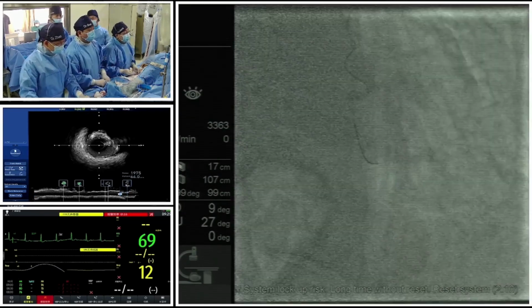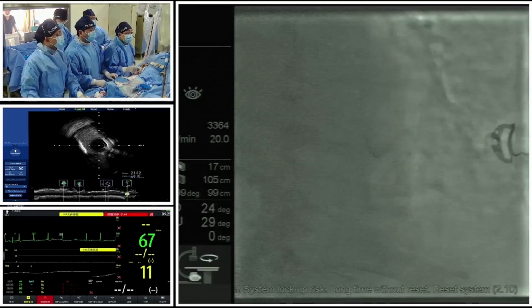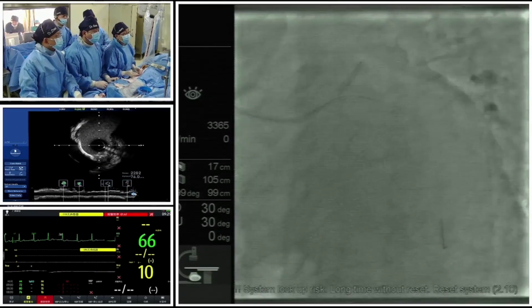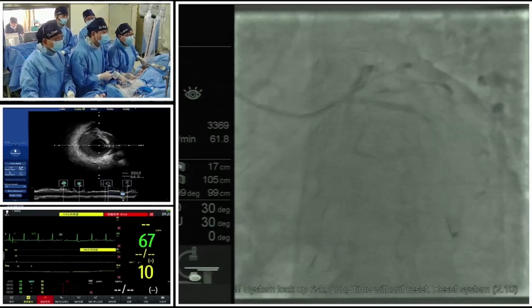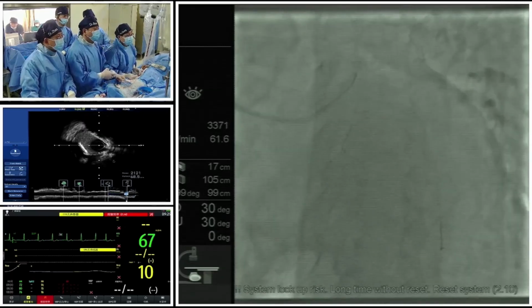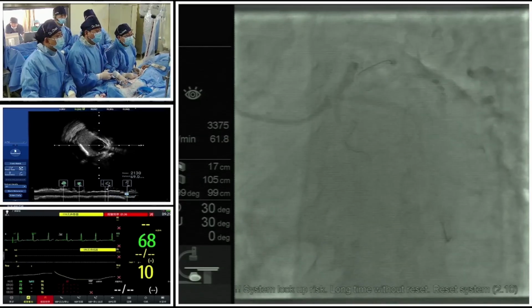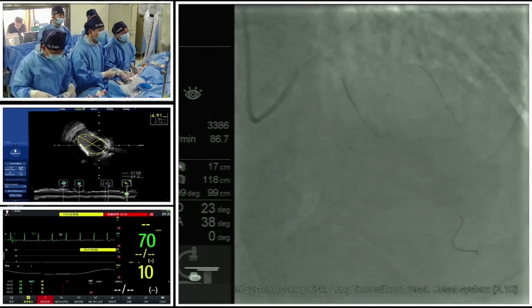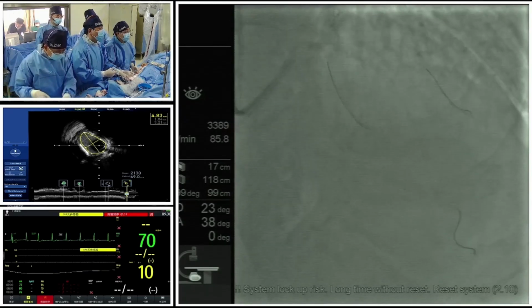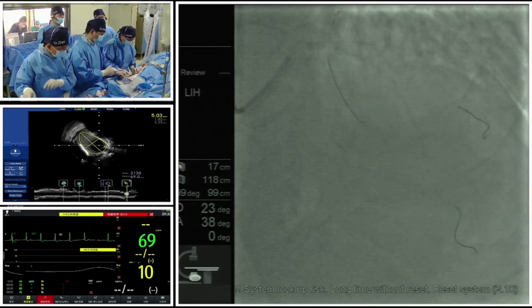Dr. Zhang, actually Dr. Gong did the pressure microcatheter FFR to confirm the results of the QFR, because, as I mentioned earlier, this is a very new technique. It was invented by a Chinese doctor. So what's the advantage of this new technique compared with the pressure wire? I think the most important advantage of this device is that it can be delivered over the workhorse wire to the distal part of the lesion.